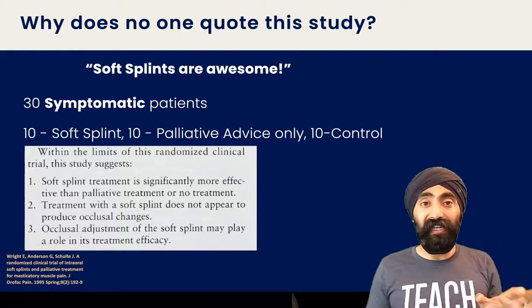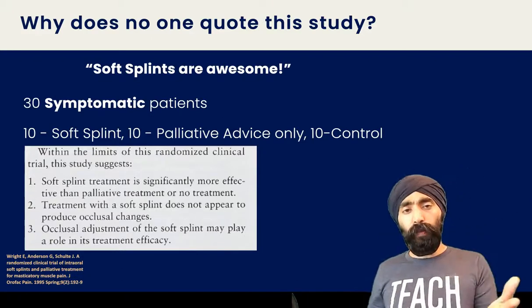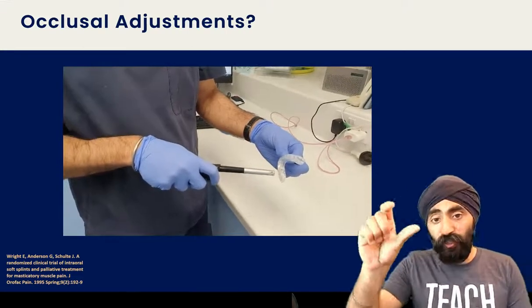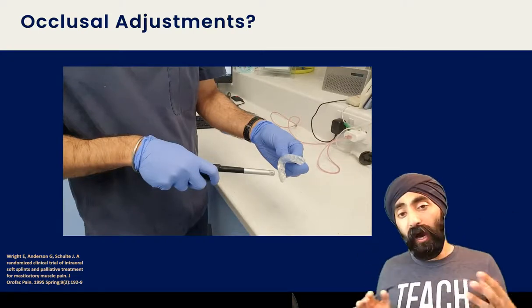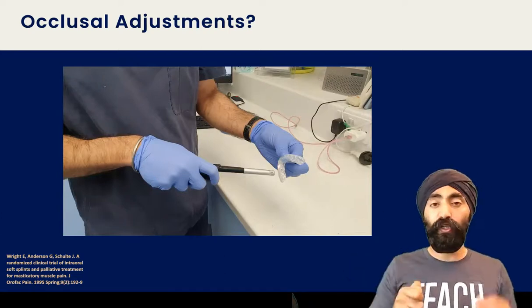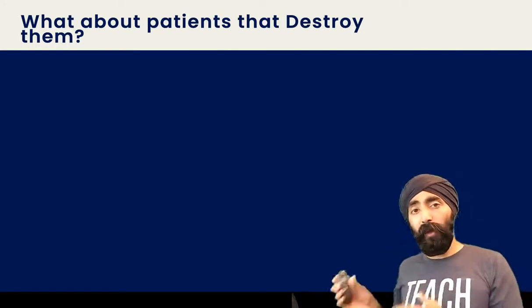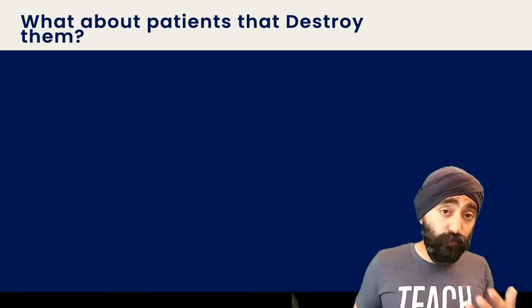So the Occlusal paper said that if you give a soft splint, it's almost impossible to equilibrate it. It actually says that word. Whereas this paper suggested a protocol whereby you heat the splint. Okay, so that's me using a flame. You just melt the splint a little bit, and then you get the patient to bite together into that. And that forms some indentations. And then you grind away the indentations, right? And so when they bite together now, it's even on both sides. So this is something that I started to do. If you're going to do this, by the way, make sure you ask for a 4mm soft splint, not a 2mm one, because you want a bit of wiggle room for when you heat it. So I started to do this. It's interesting how one paper said that it is really rubbish, and the other paper, which had a different protocol, and they're both completely different papers, argues that splints can be useful and help patients with pain.